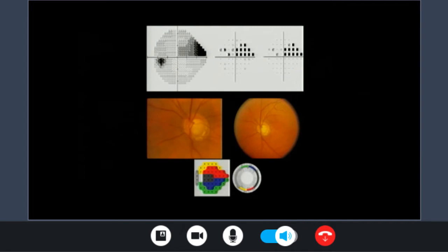It represents to us a yellowish and a reddish zone, which in the visual field will be superior. That's the reddish and that's the yellowish zone, and it correlates nicely with the visual field printout. So once you examine a patient in your clinic and follow him up, and you find that the patient is having progressive thinning inferiorly, you can predict that in the future the patient will have a superior scotoma. Once this thinning progresses, let's say inferotemporally, you will realize that this area is jeopardized, and this area represents this reddish zone here, and it's near to fixation.